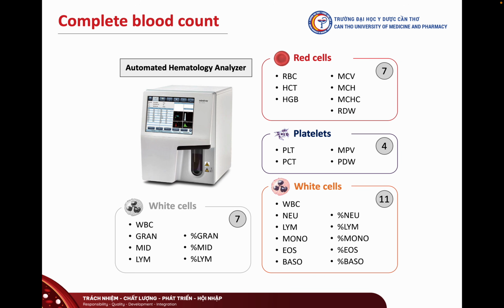Another important point: most hematology analyzers today are designed to recognize and classify the normal peripheral blood cells, red cells, white cells, and platelets, based on size, granularity, and other physical properties. However, when abnormal cells appear in the peripheral blood, like blast cells, nucleated red blood cells, or other immature forms that typically belong in the bone marrow, the machine may struggle to identify them correctly.